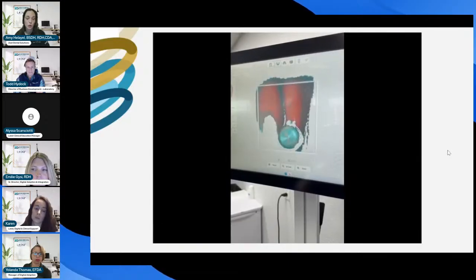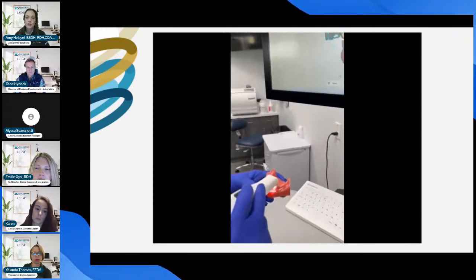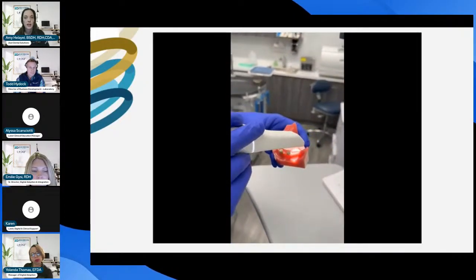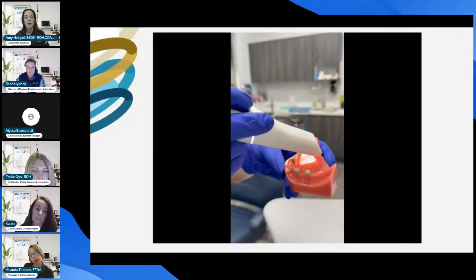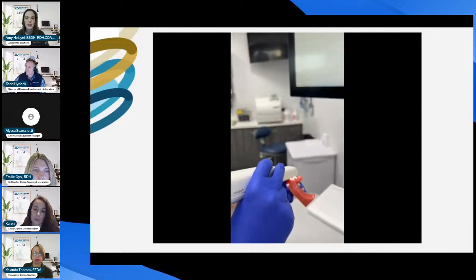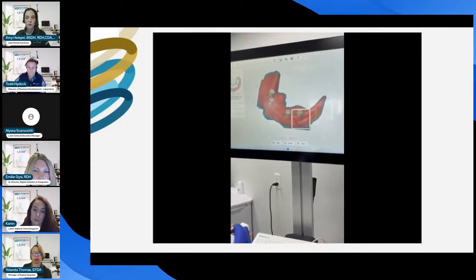the locator scan bodies. So you can see you're going to start your scan as you traditionally would, move around the mouth, and trying to capture all of the anatomy. Our assistant is scanning the lingual, obviously the occlusal, the buccal surfaces, trying to get in the vestibules, and capturing all the necessary anatomy. And again, Leixir is going to be reviewing all of that with you tonight.